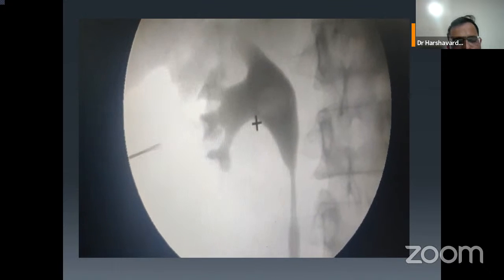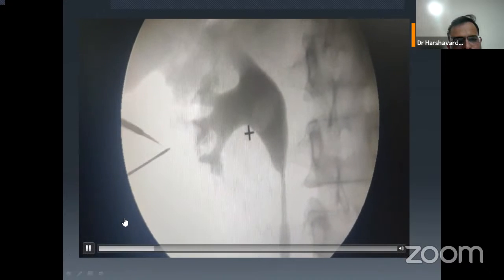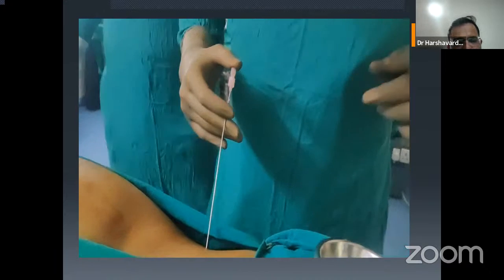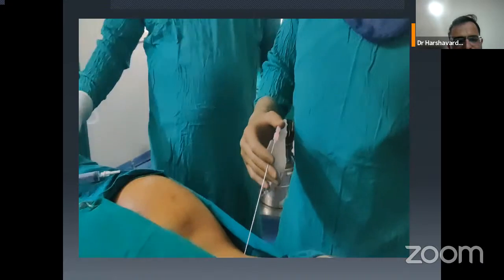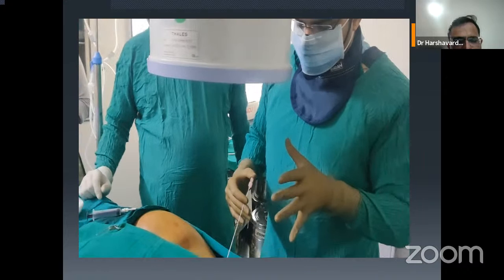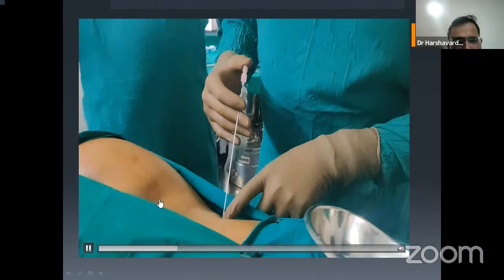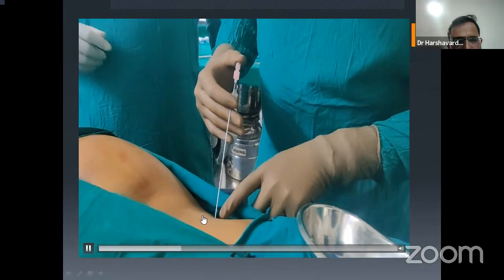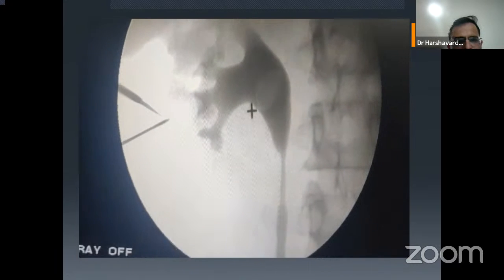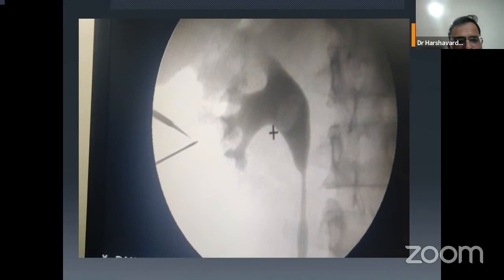You can see I am doing this puncture in a 0-degree monoplanar technique. We have marked the site of the puncture, again oriented our needle 30 degrees to the skin surface of the patient. The depth has been calculated that around 2 to 3 centimeters I have to go in vertically and then orient towards the calyx, so that the cup of the calyx is targeted.